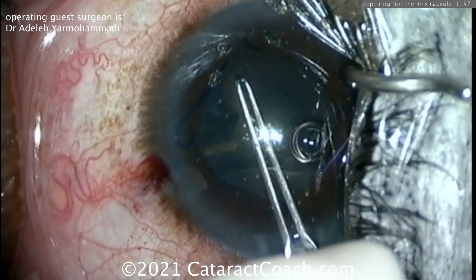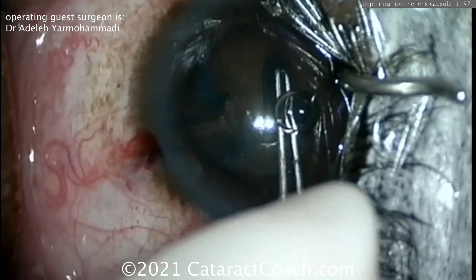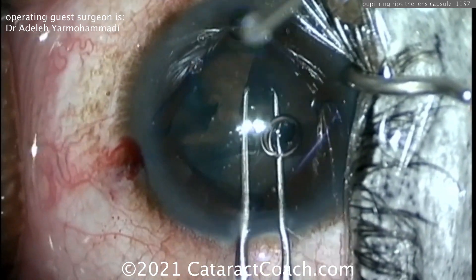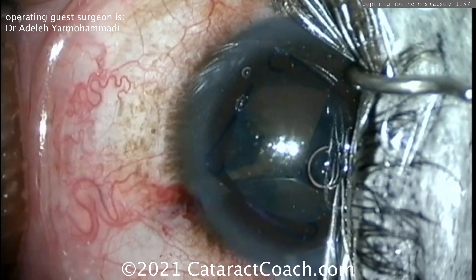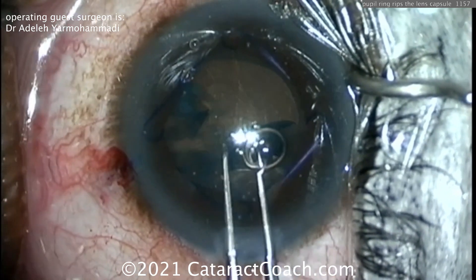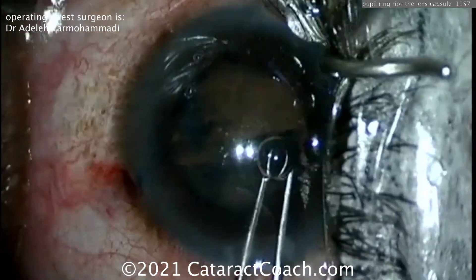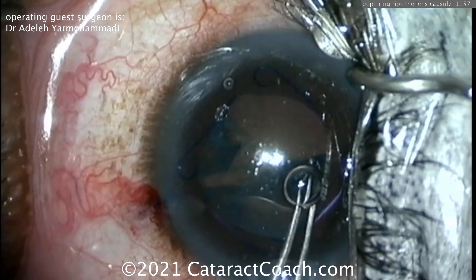There are the capsule forceps — going clockwise. Beautiful, very nice. Try to keep that eye in primary position — there you go, better, good. Remember: complications can't be avoided. The only two surgeons who never have complications are those who don't operate and those who lie about it. If you operate, you will have complications — the key is to recover from them, like Dr. Adele is doing here.